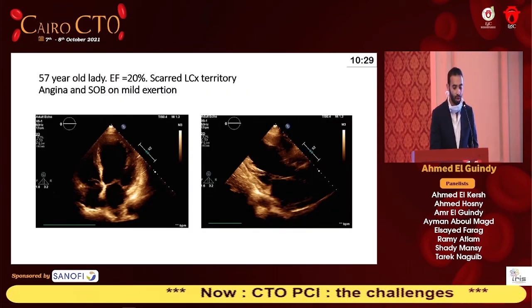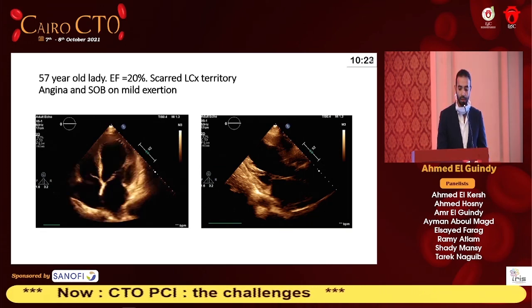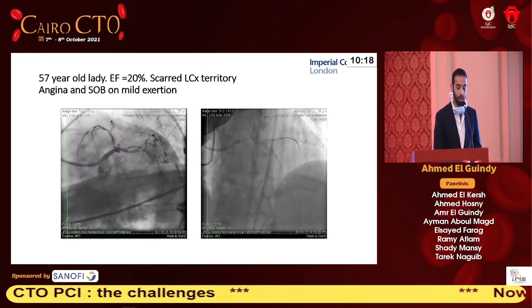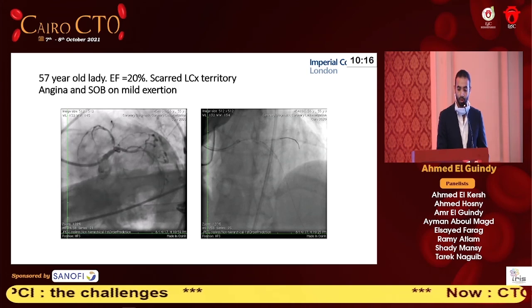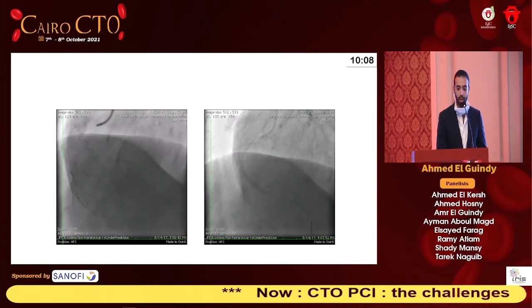The best thing is to have a quick look at one of the patients, a relatively young lady, EF of 20% with a scarred LCX territory, and the videos are, anyway. So you can see, for the sake of time, this was a very short CTO of the LAD. I'm not sure why this is freezing, but anyway.